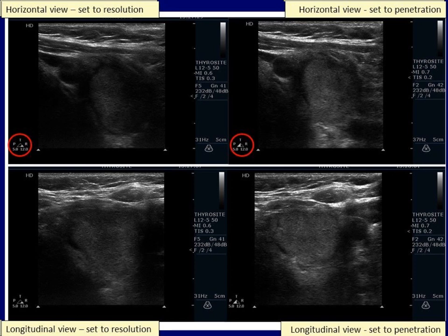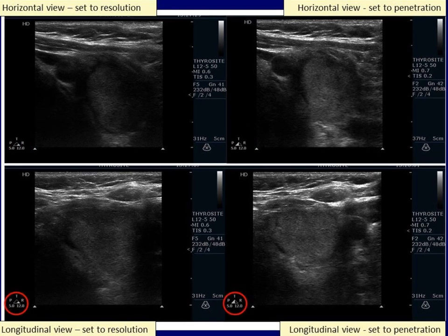In the lower images, the same changes in settings led to the same consequence. It is worth comparing the presentations of the nodule with the wrong and with the right settings.